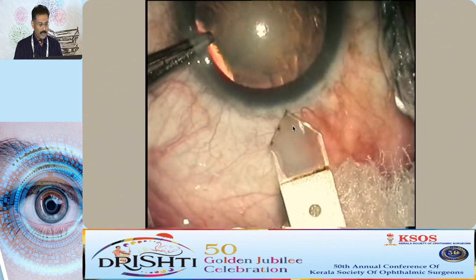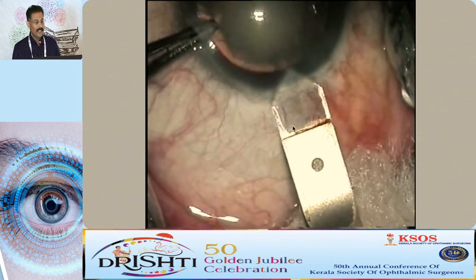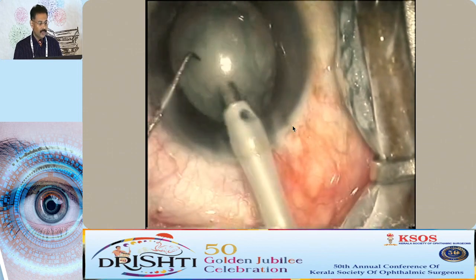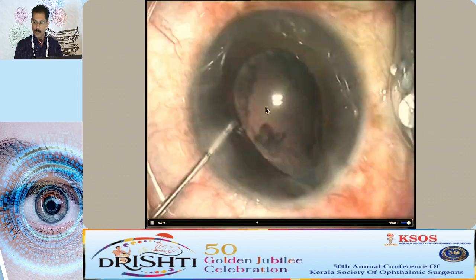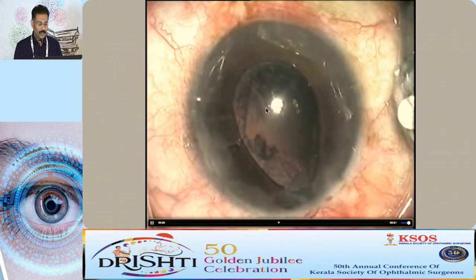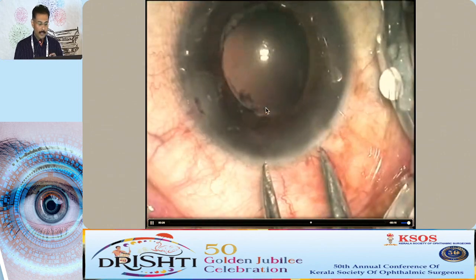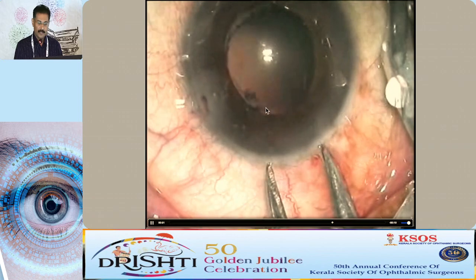This is one case where I found a diamond blade. I was excited to use the diamond blade, and I just used it. It looked okay, but then it was looking a little larger. I thought I'll go ahead with this, but see, it is so large an incision that iris just keeps coming into the incision. So the pupil will go down, you will have iris chafing, you will have burning of the iris, all those things, and it will be a messy surgery. So do not go by what your company person is suggesting for their sleeve, and use that keratome.